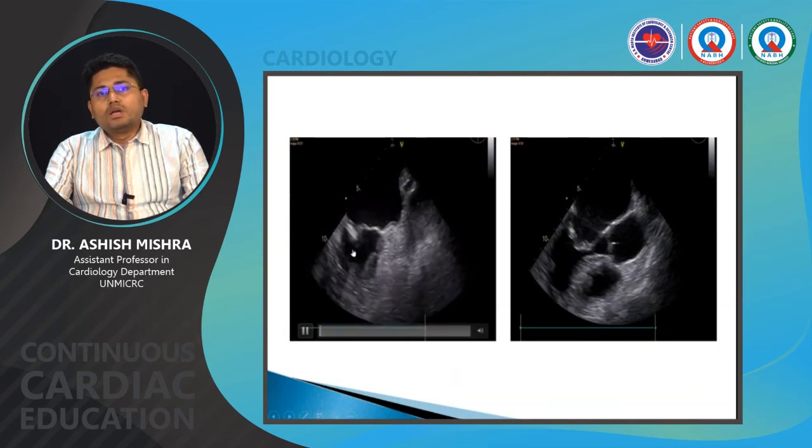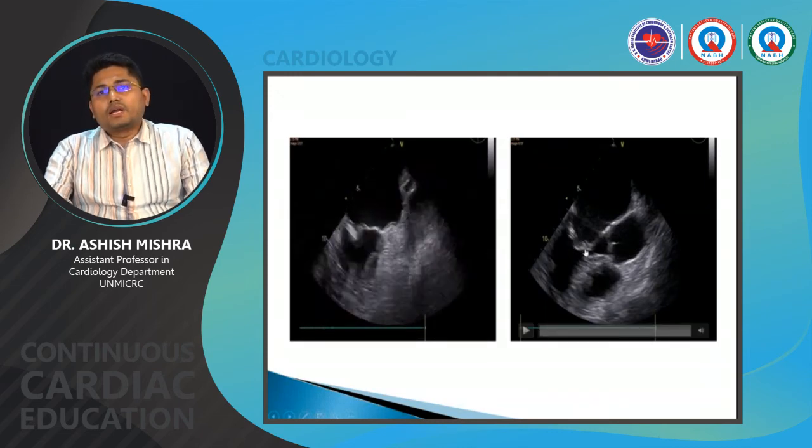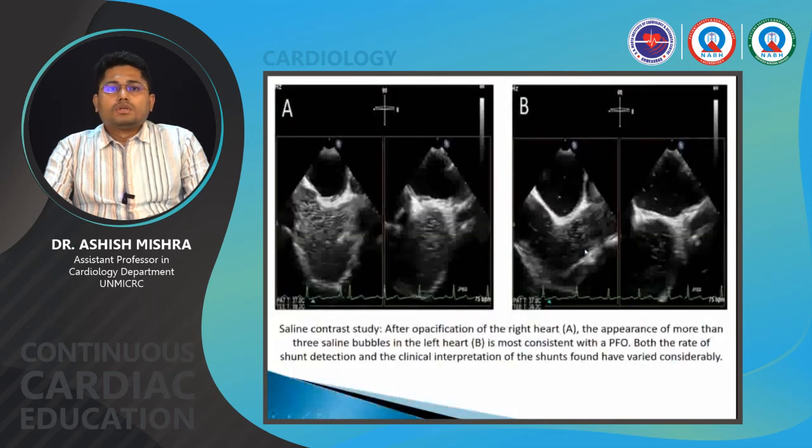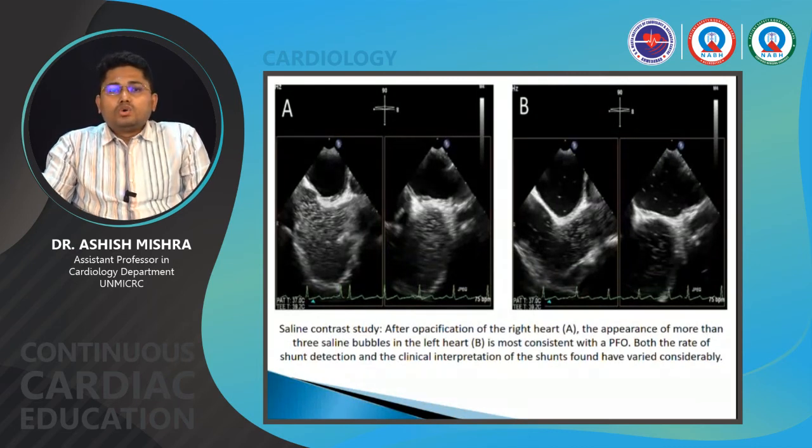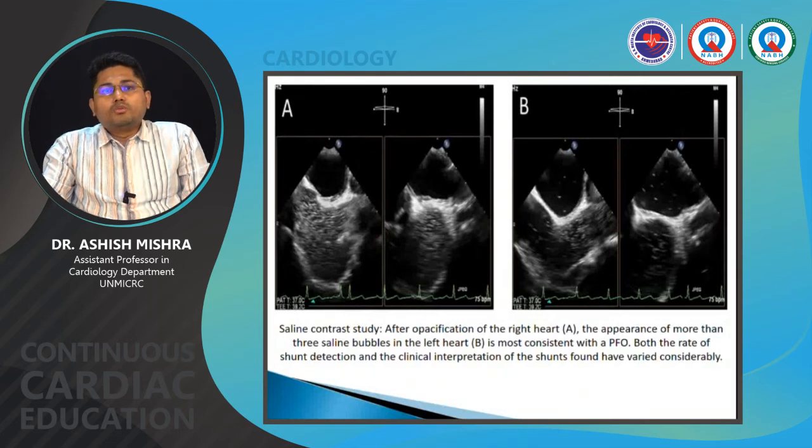We can see the doming of the atrial septal aneurysm, and also the relationship between the aortic valve and the mitral valve over here. Also, while acquiring the transesophageal views, particularly in a stroke protocol, we should also do a saline contrast study, particularly to bring out the underlying PFO.